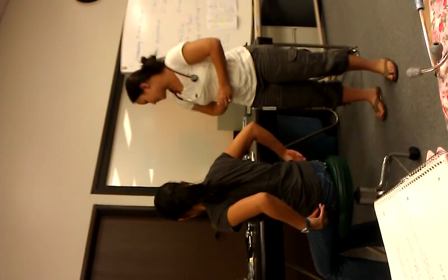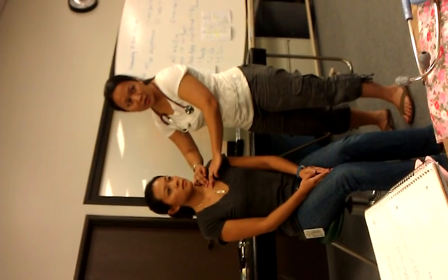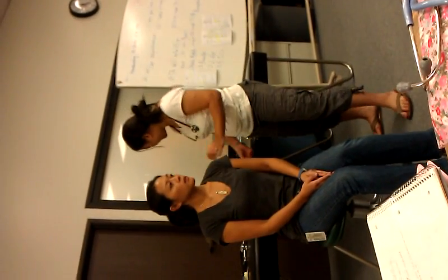And then next is auscultation. Some considerations would be, if she was an older patient, I would ask the patient to move her breast out of the way. Make sure that you're not placing your stethoscope on her clothes. Make sure it's directly on the skin, not on any leads or pads or on the ribs. So make sure that you palpate first for the intercostal space instead of placing it on the rib. Okay? And then, again, there's 12 positions on the front, 14 on the back.